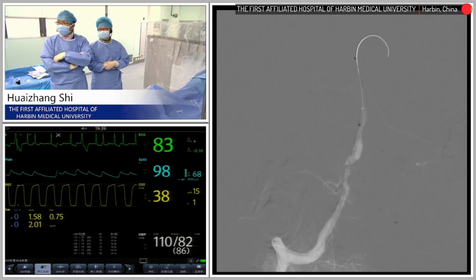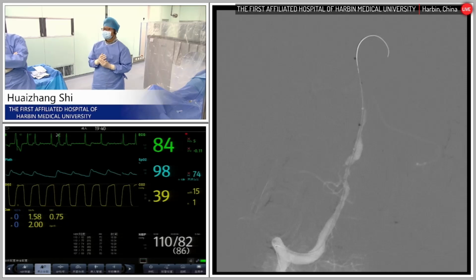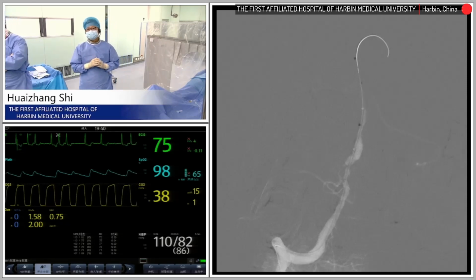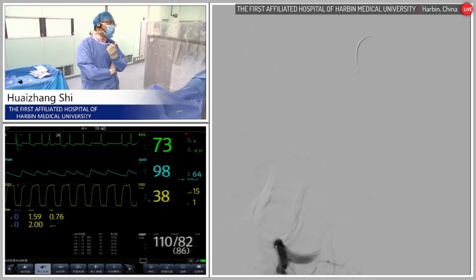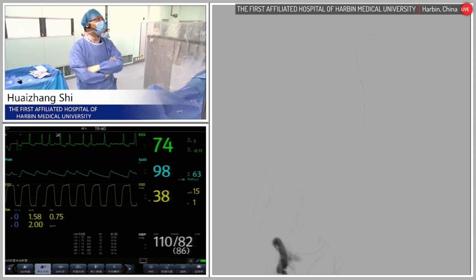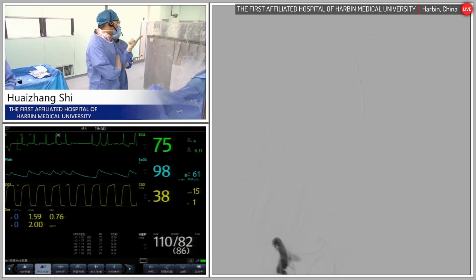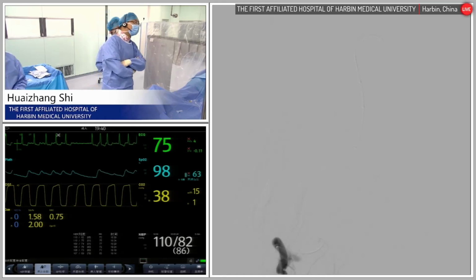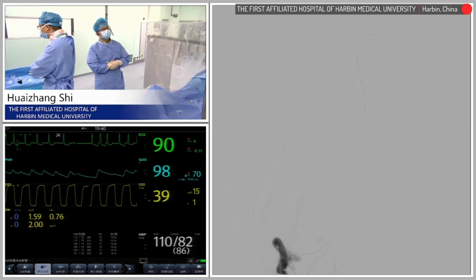What length is good? Maybe 23, sir. The length? I will measure it. Okay. Doctor will choose a stent here. The length, maybe 16 or 23 because he has the two tabs. 23, sir? 23. Okay. 23.